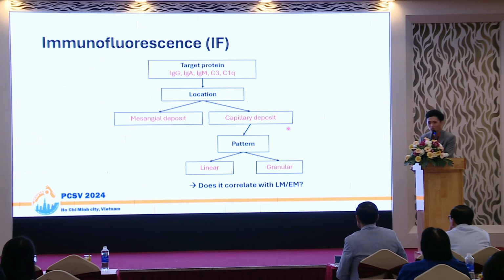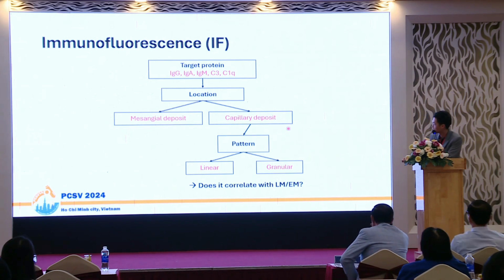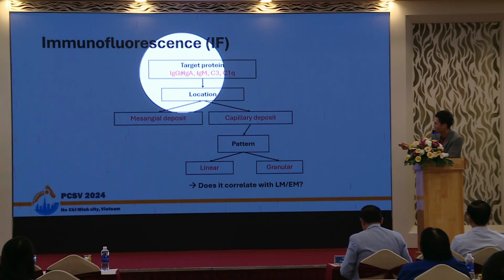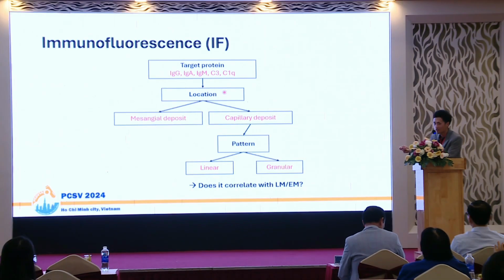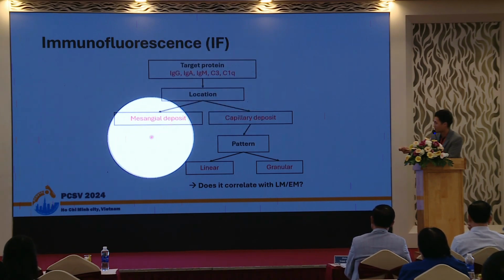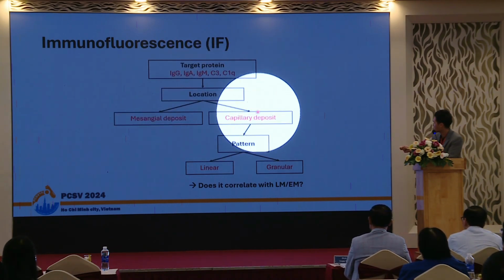So the basics of IF interpretation is, first we identify what kind of protein or what markers we are using. And if it is positive, we determine the location, if it is mesangial or capillary wall.